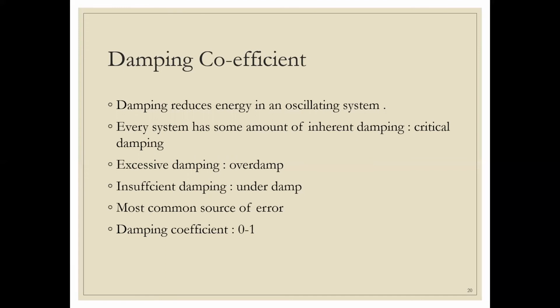Now, once this damping is very excessive, you can take damping as a kind of friction. So when the friction is very high, what will happen? The system will not oscillate, and readings will not be proper. This is known as over damping. If damping is low, suppose the system is very compliant, the material is very flimsy, there will be no damping at all. There will be no friction offered. As a result, whatever resonance or oscillation is happening will be too varied, too high. So that is under damping. So friction is very less. This is under damping.